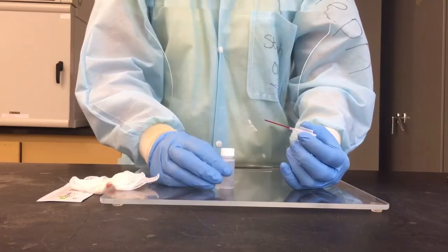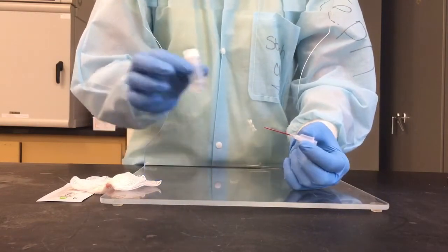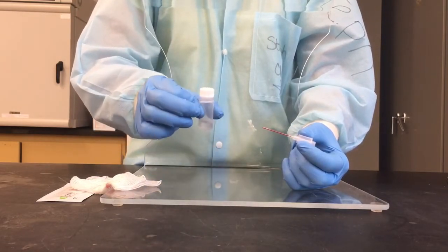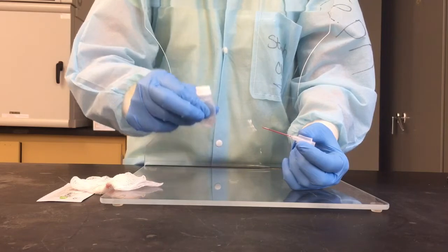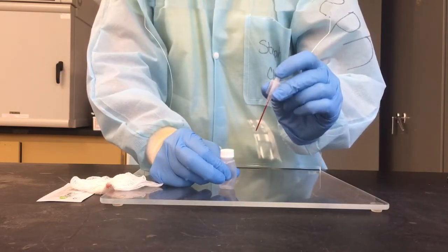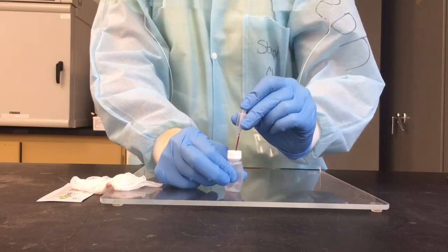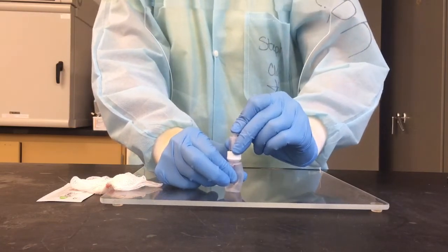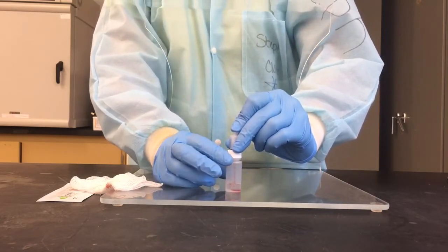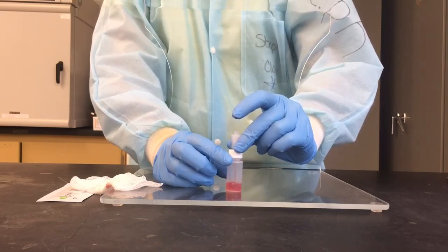Now this is, I think, the trickiest part. So now we need to take our specimen from our capillary tube and we need to transfer it into our reservoir. The way that we want to do this is by gently squeezing the sides of our reservoir together, one finger over the top of the capillary tube, and then take it and insert it all the way in. Let up on the sides of the reservoir, and then let your finger off of the top of your capillary tube.